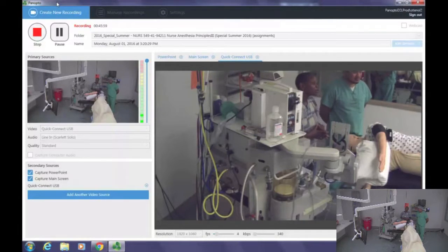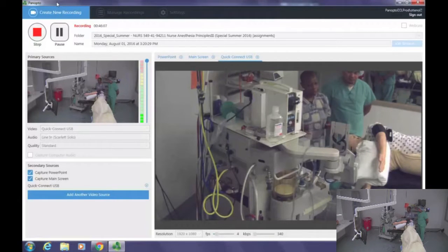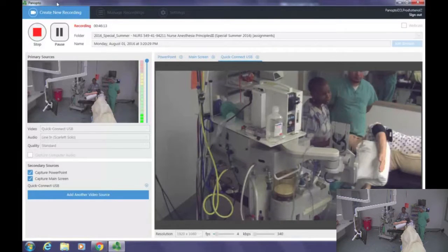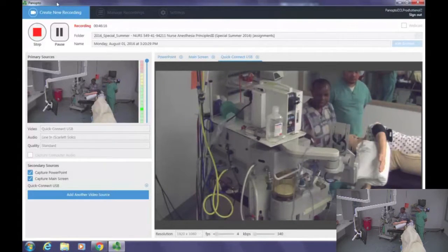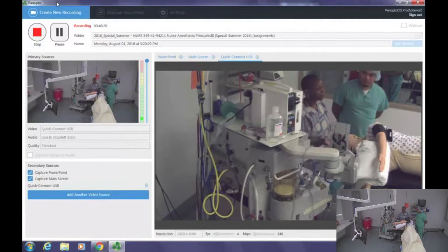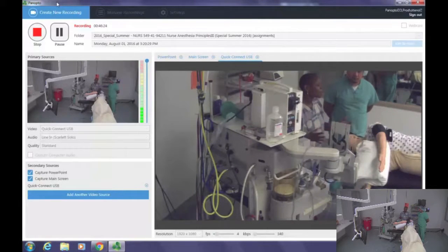And then also the surgeon is going to place a chest tube in the patient. He's going to want to know if you're losing any volume, so you need to be able to know how much tidal volume you're on. For instance, if you're on 700 mLs and you're only getting about 300 mLs of volume, then you probably know that you're losing about 400. But it's going to get better once this chest tube is connected to suction.